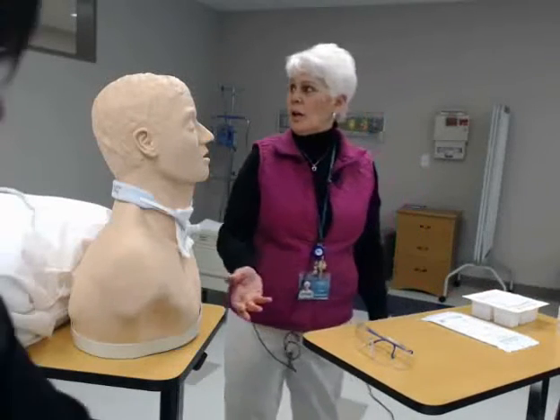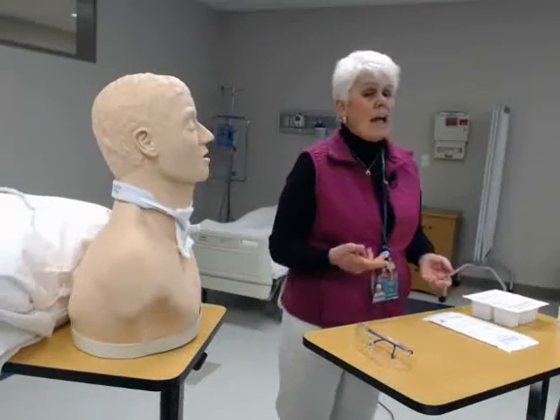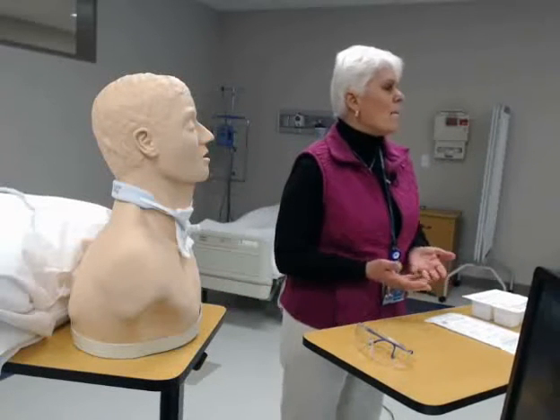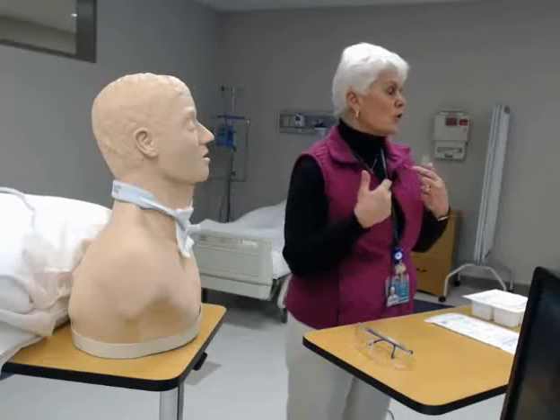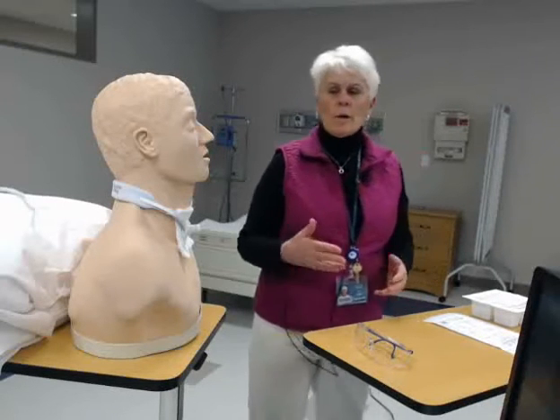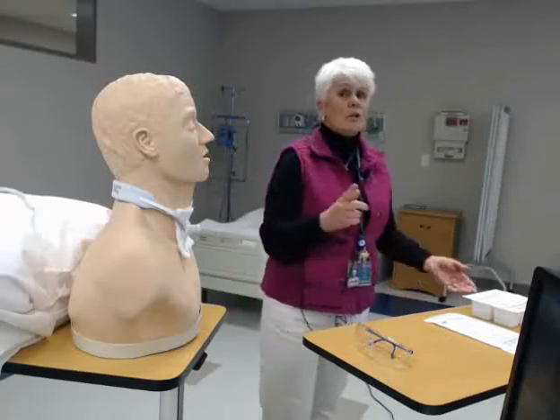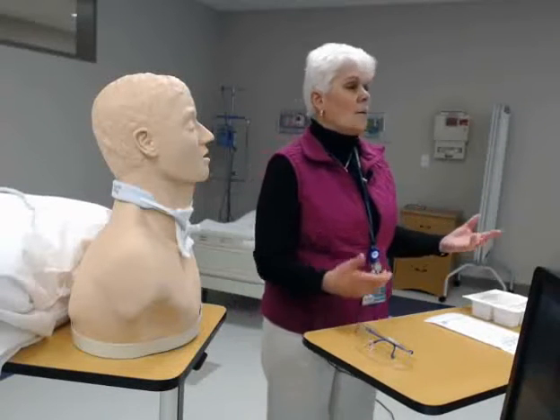You're going to walk into your patient's room, introduce yourself, and identify the client. Explain to them exactly what you're going to be doing so they're not scared that you're sticking things down their trache. Explain the procedure, see if they have any questions. Then wash your hands and provide privacy for your patient by pulling the curtain around or closing the door.